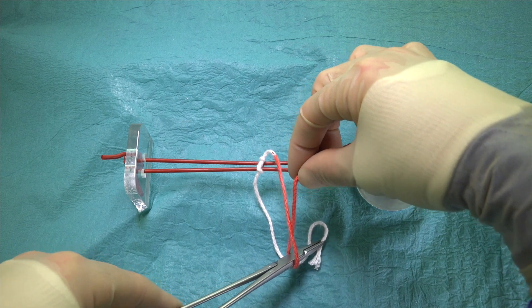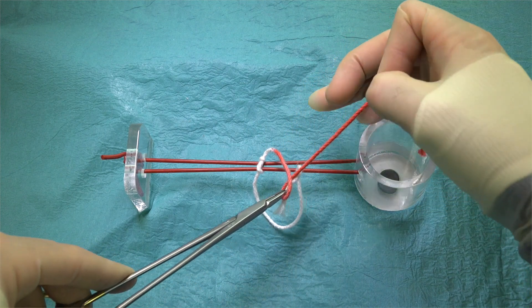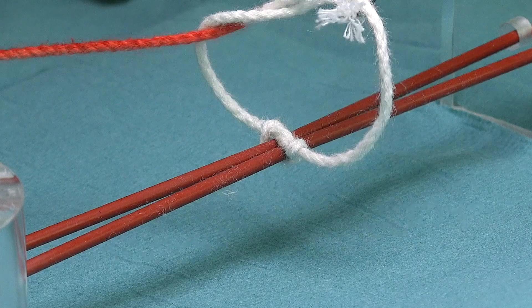The instrument is then used to pick up the suture end lying closest to us, and pull it through the loop, taking it away from us in the process.